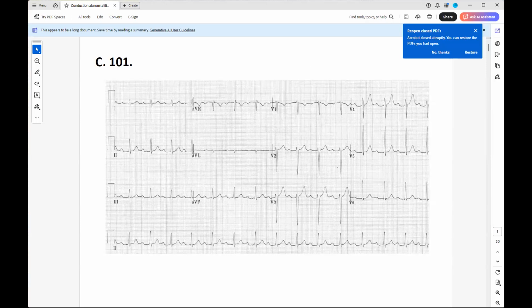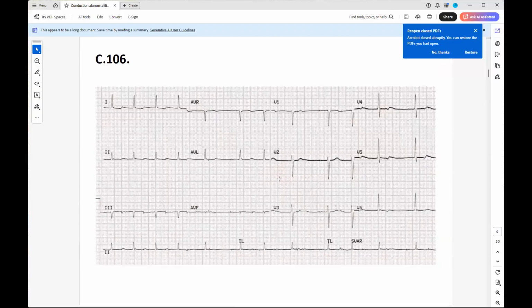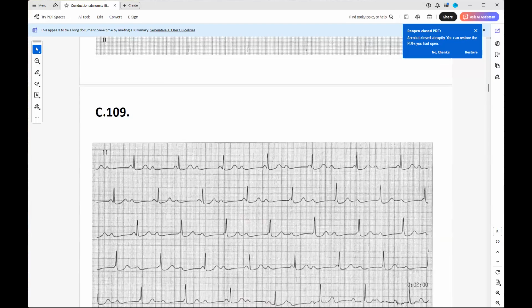I have my tracings on my iPad, but I'm on my laptop for the Zoom. So if you could share the screen for mine, that would be helpful. Okay, Sebastian, let's look at which one that you had. 109, yes, 109. Okay, 109. I'm going to go there. Yes. Okay, it's your turn.